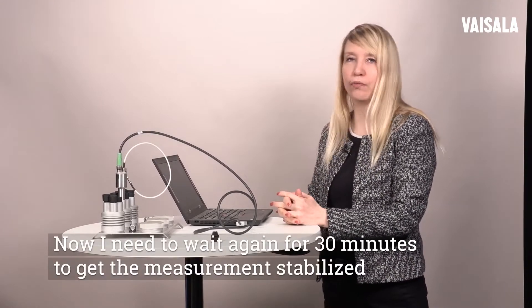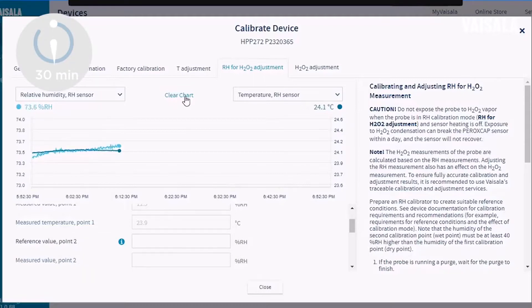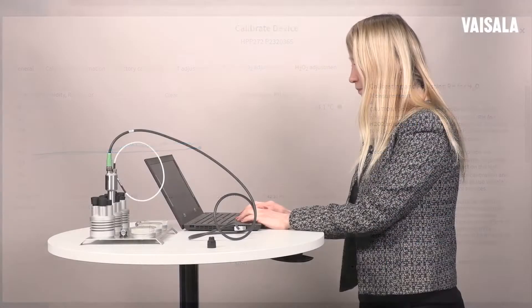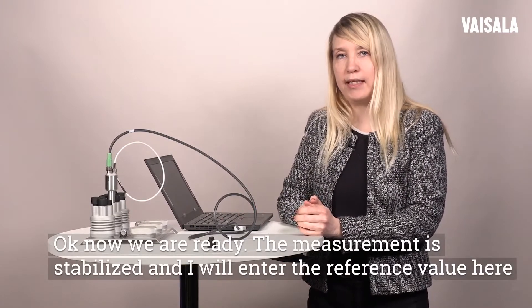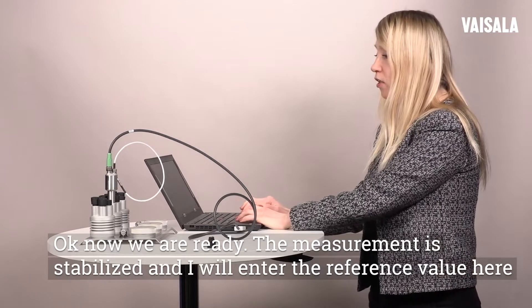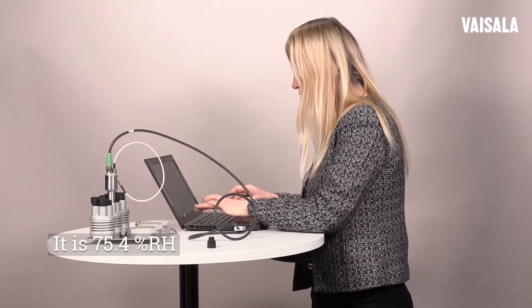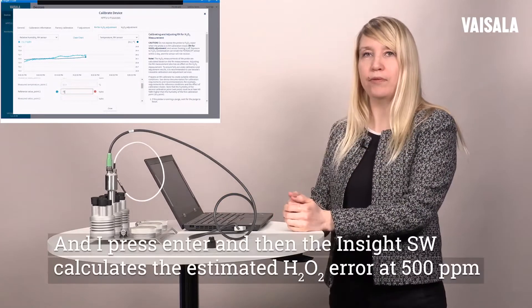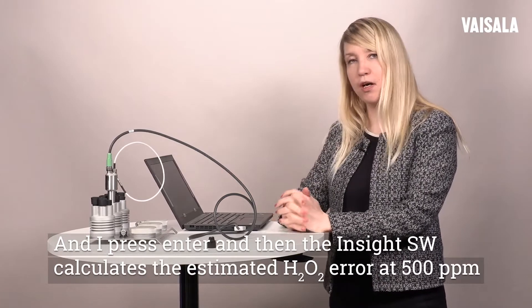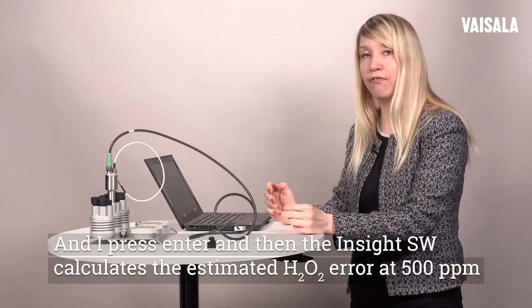Now I need to wait again 30 minutes to get the measurement stabilized. Okay, now we are ready. The measurement is stabilized and I will enter the reference value here. It is 75.4. I press enter and then the Insight PC software calculates the estimated H2O2 error at 500 ppm.